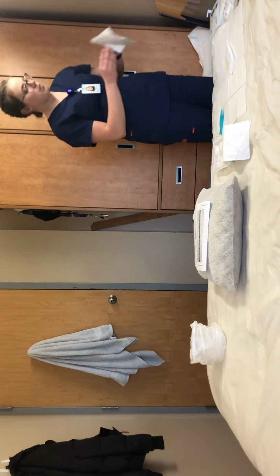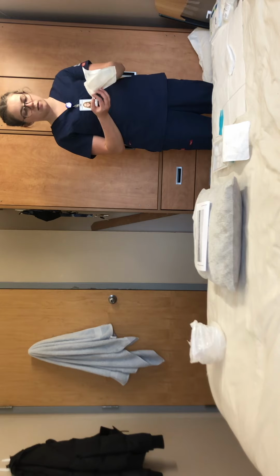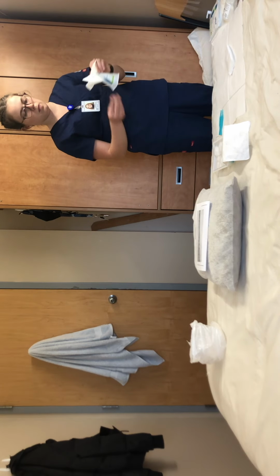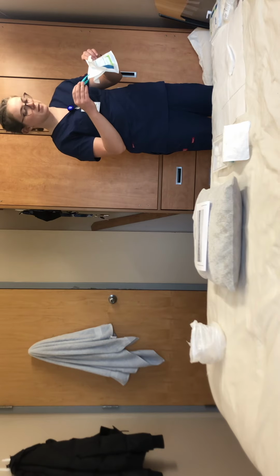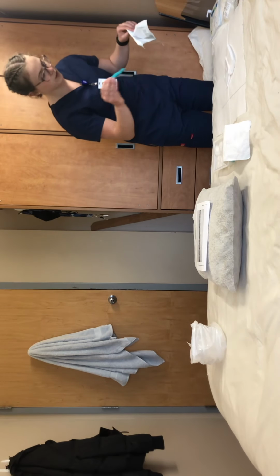Then I'll be opening up my 4x4 gauze. And I'll be dropping all of my supplies 6 inches above the sterile field.